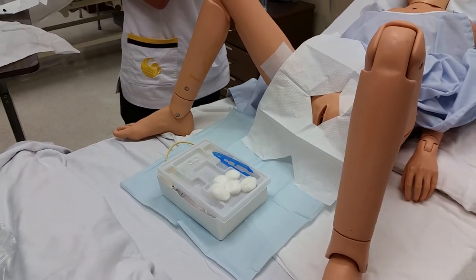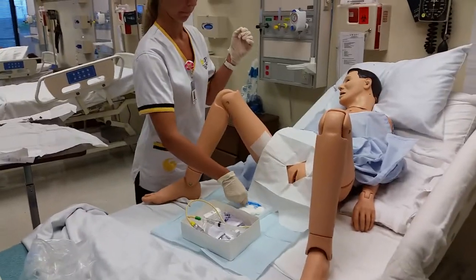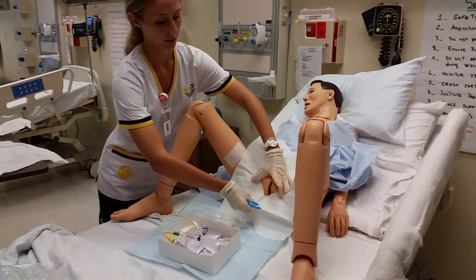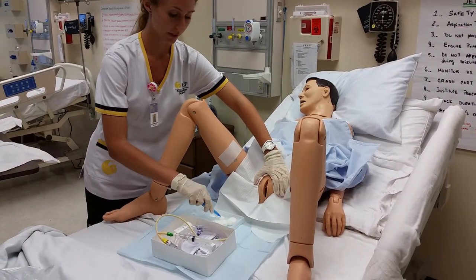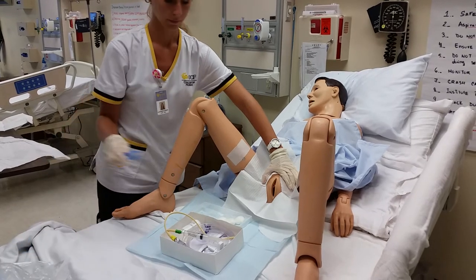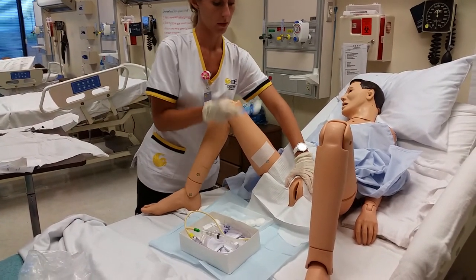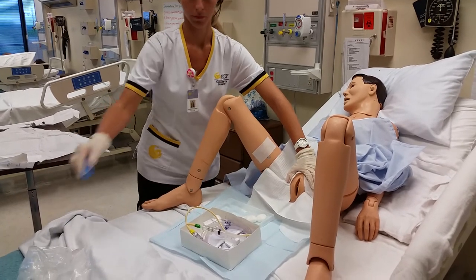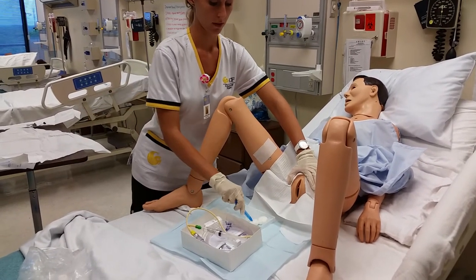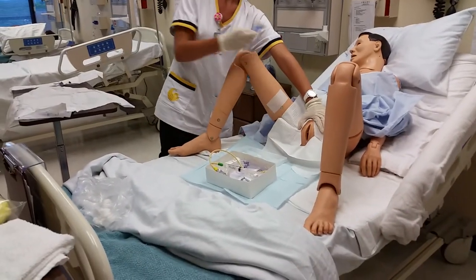Okay, so this is where our patient needs to be very careful not to move around too much. I'm going to go ahead and clean the area. This is going to be my dirty hand, or my clean hand, I should say. And I'm still sterile, so I could go ahead and move this. Now my hand's locked, I'm going to go ahead and clean. I'm going to start from the outer. Down the middle again, being careful to go from front to back.